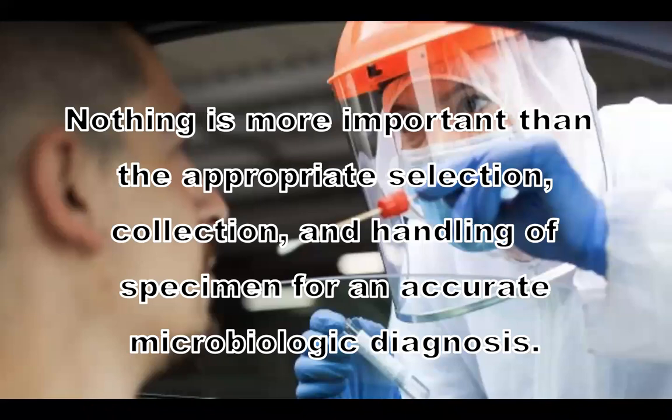Okay. So remember that nothing is more important than the appropriate selection, collection, and handling of specimen for accurate microbiologic diagnosis. Okay. So the different samples that we process in the lab include blood, we have respiratory tract specimen like sputum and nasopharyngeal swabs.